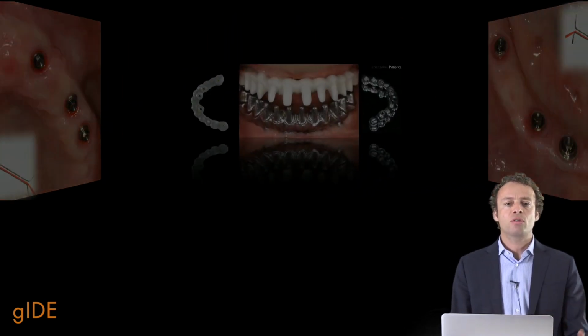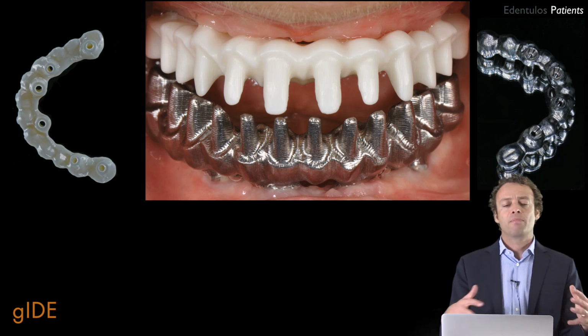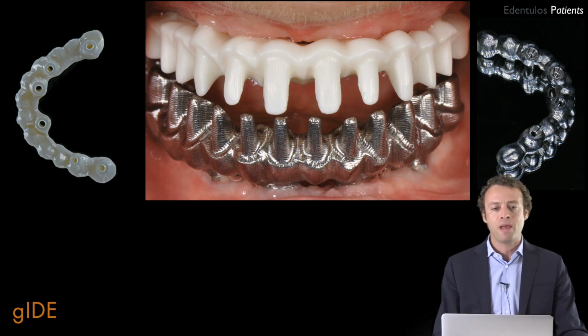In this way, of course, working with a good impression, we can achieve this kind of framework that can be realized in titanium or in zirconia in relation to the biomechanical aspects that we have for each patient.